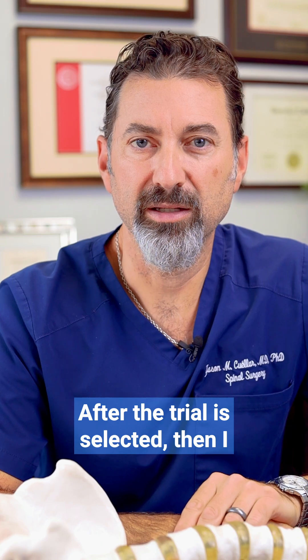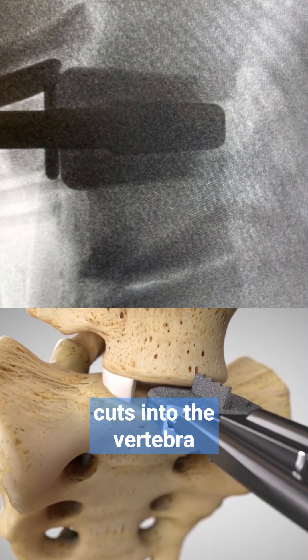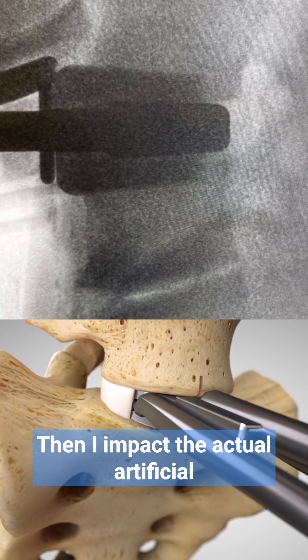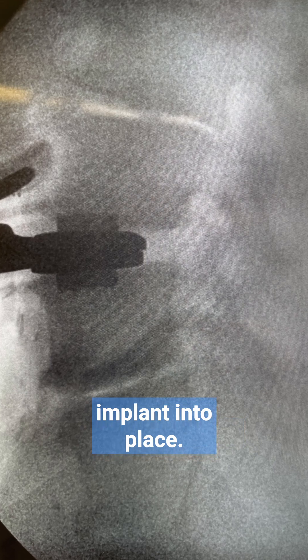After the trial is selected, I impact a chisel which actually cuts into the vertebra above and below the disc space. Then I impact the actual artificial disc replacement implant into place.